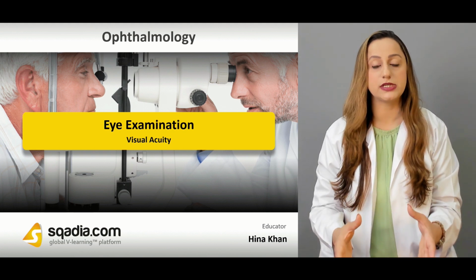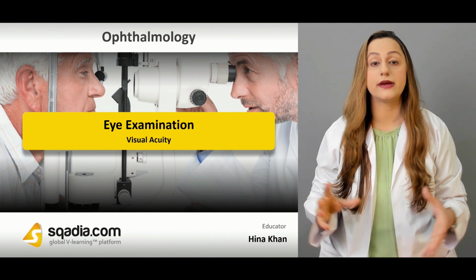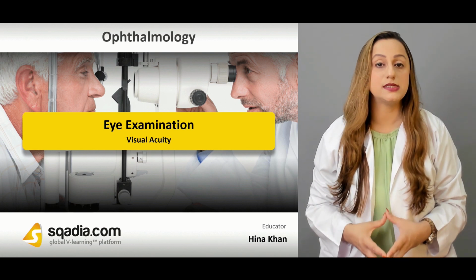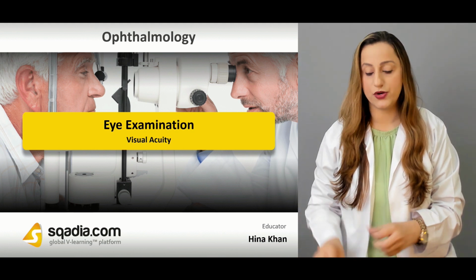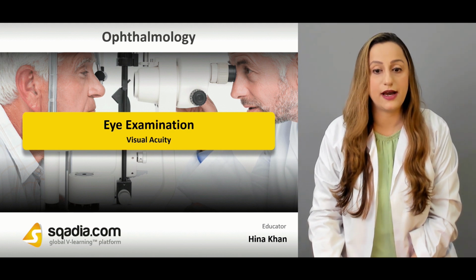You have that patient sitting with you on the slit lamp. You have that particular exposure towards the eyeball, and you have examined or inspected the eye in detail and documented any abnormalities if they are found, and you have written them down on your examination or history taking paper that you have.